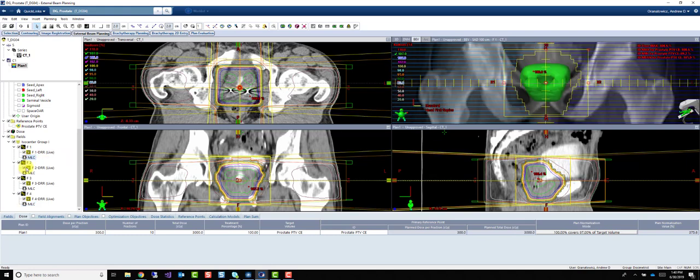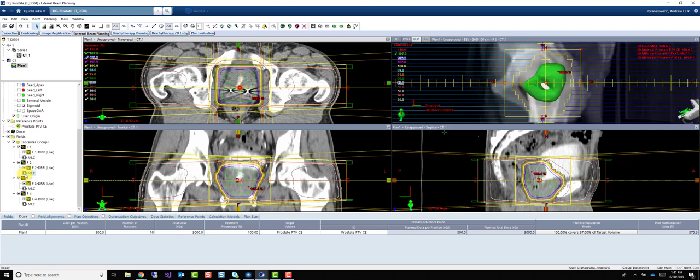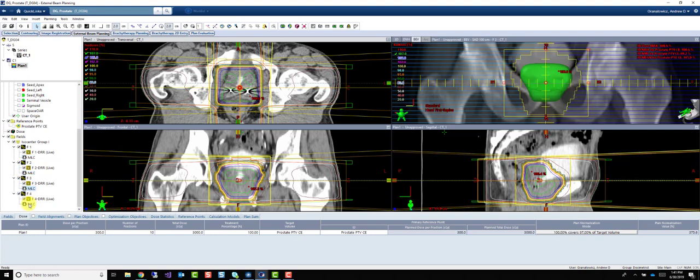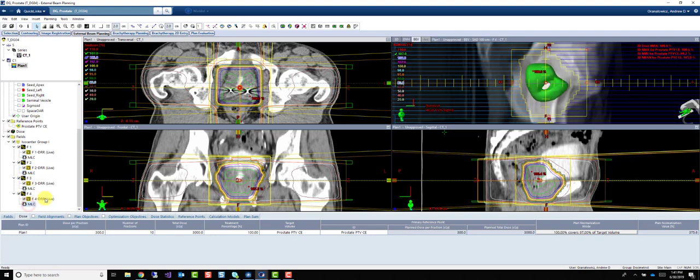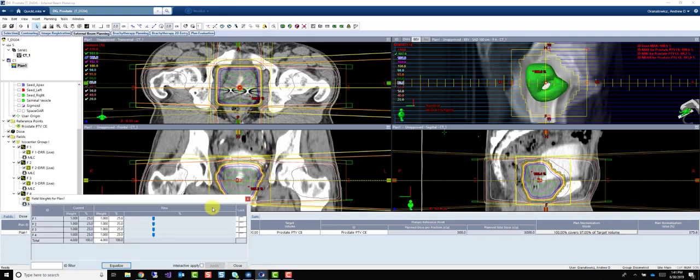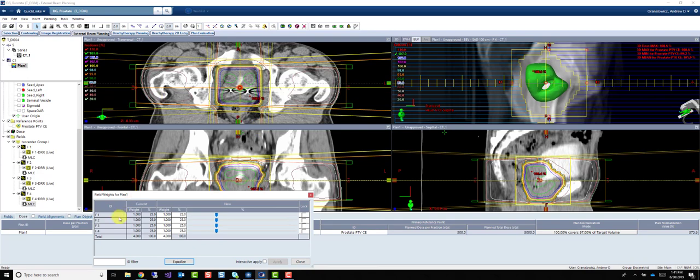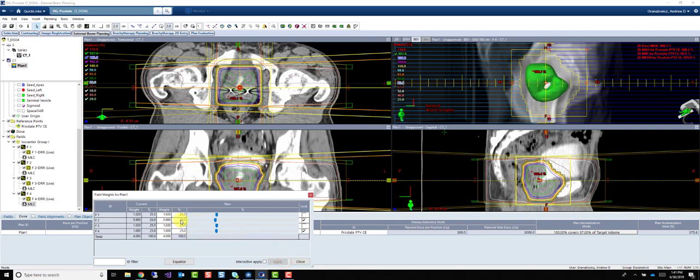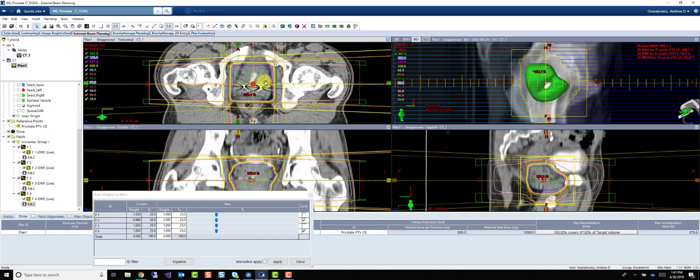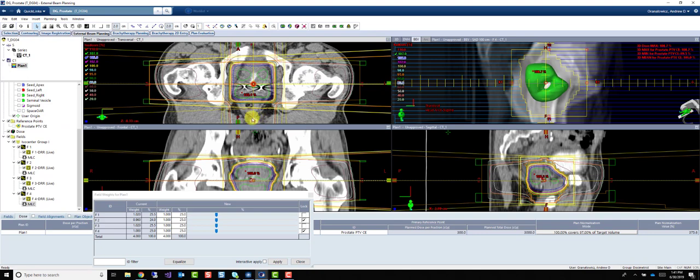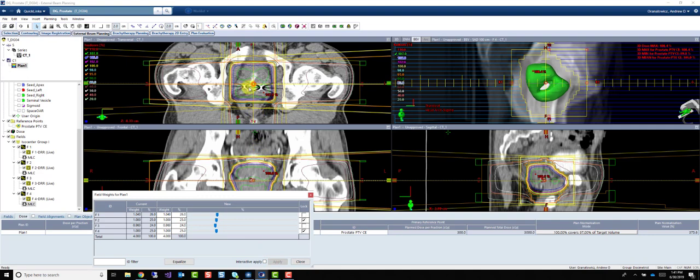So the only problem with something like this, is you can see that 107, it's all very central. There's nothing really along the edge in all these beams I've used. So we can do a couple things. I can tell that the weighting is skewed a little bit posteriorly, so I can lock our lateral beams. So F2 and 4. And take a little bit away from the posterior beam. Oops, that's the wrong beam. I need F3. F3 is our posterior beam. 24.